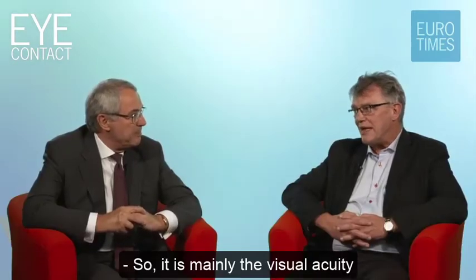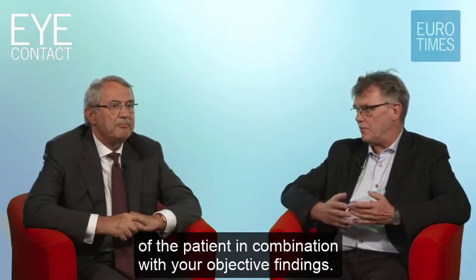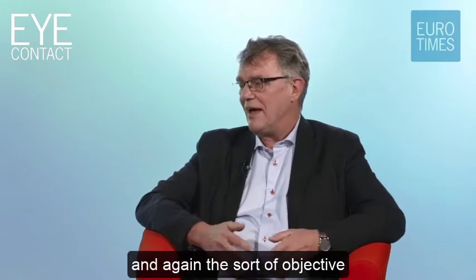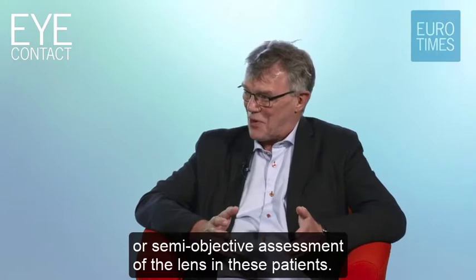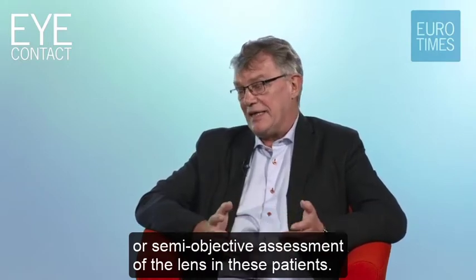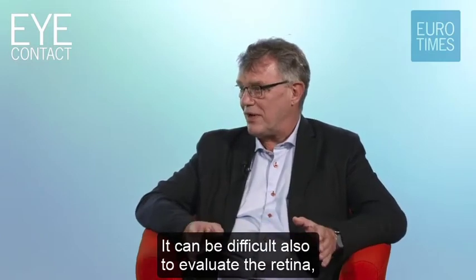So it is mainly, of course, the visual acuity of the patient in combination with your objective findings: the degree of opaqueness of the cornea, and again the objective or semi-objective assessment of the lens. In these patients, it can be difficult also to evaluate the retina.